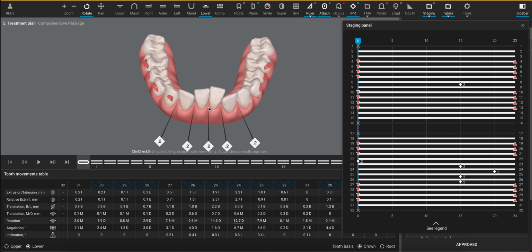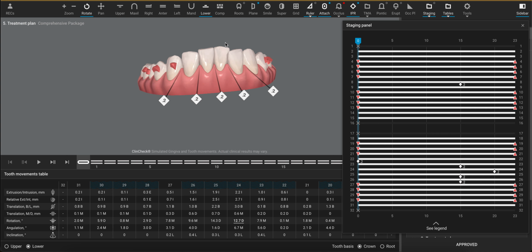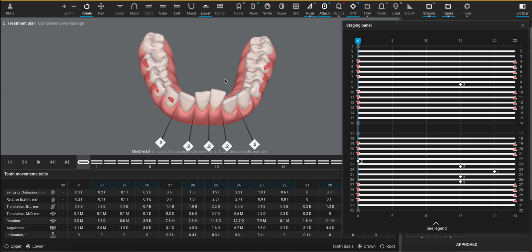So it's in alignment with what you were saying, but I'll take it one step further and say we pause in this current tray, keep the patient where they're at. I might even consider splinting them. I think what I would do is have the patient stay in the current tray for a month, bring them back, and if you don't see any decrease in mobility, then I might splint them and put the patient into an Essix and just pause treatment, and then we'll go from there. I've had this happen a lot, so I don't think it's something that we should lose sleep over.